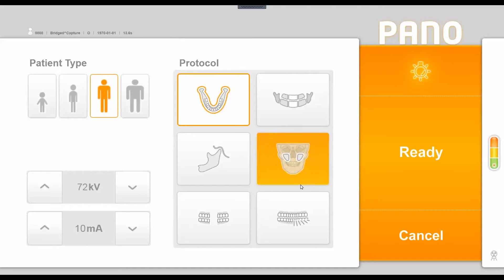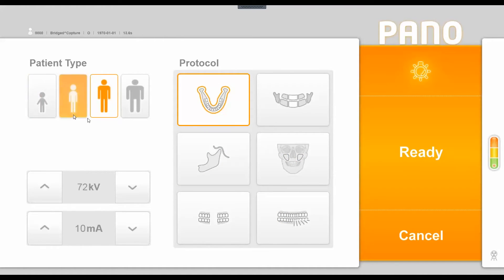Once in the interface, we have options to choose our patient type — from a child setting to small, medium, or large adult. It defaults to medium adult. If the preset sizes are not adequate, you can change them using the manual adjustments of KV and MA in the lower left corner.